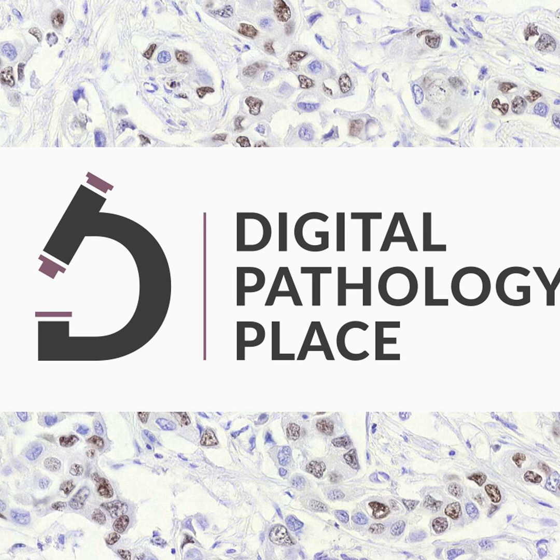You can also, with fluorescence, the whole idea behind fluorescence is capturing fluorescence at its peak. So fluorescence slides degrade sometimes rather quickly. So if you can capture them at their peak of fluorescence, they'll never be better than that. And if they degrade, you already have the digital image of it. So it's not as big of an impact to you if the slides degrade over time.